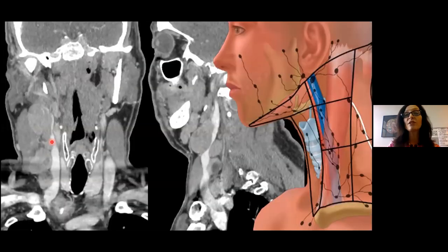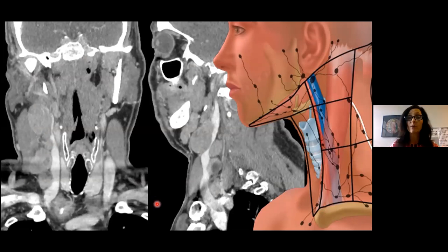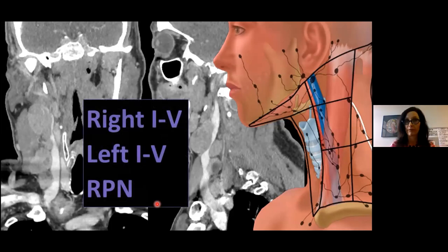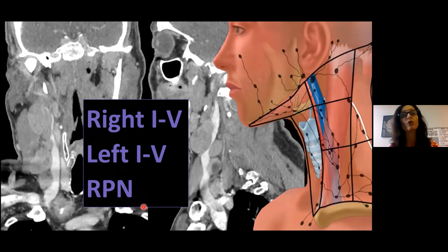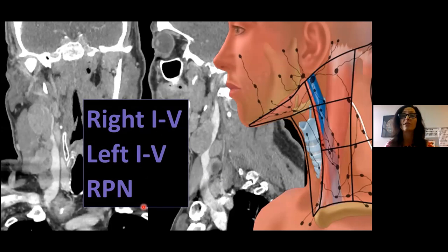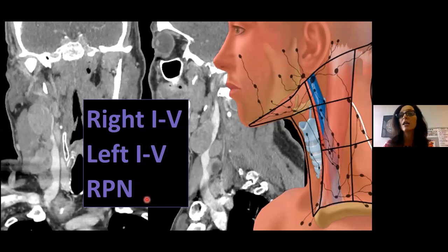For pitfall one — just missing nodes — develop a really consistent method of looking at lymph nodes. There are 300 nodes in the neck, and we're not here to report every single one, but we need a systematic approach. Before finishing a dictation, go down the right neck, the left neck, and look at retropharyngeal nodes right and left. Develop a pattern so you're forcing yourself to look for lymphadenopathy. Once you get used to how head and neck tumors metastasize — for example, thyroid going to the retropharyngeal nodes — remind yourself to look for those every time.